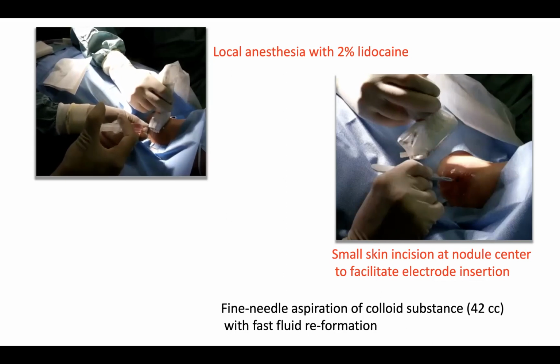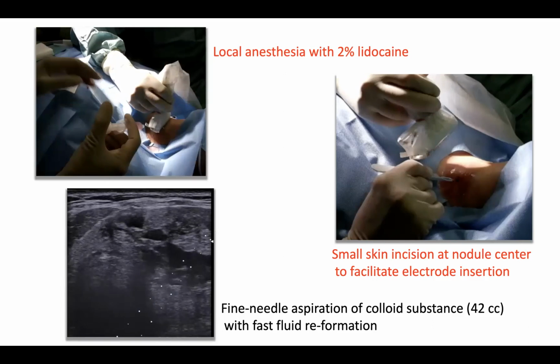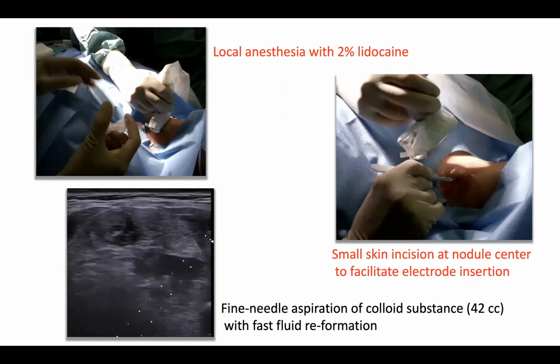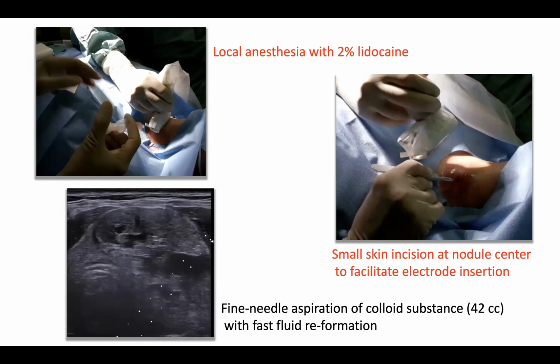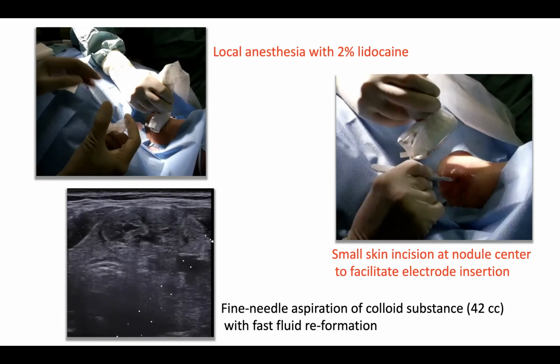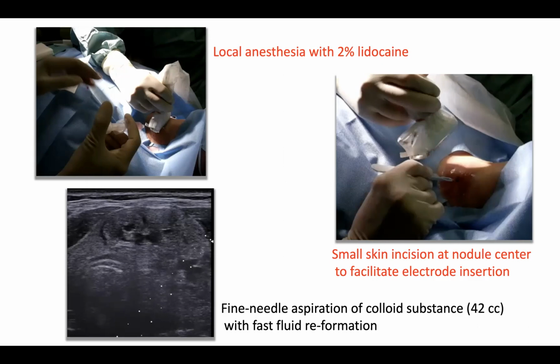Initially, during the procedure, we tried to extract from the lesion almost all the liquid content. And we were able to aspirate 42 cc's of fluid, but we noticed a very quick reformation of the fluid, making the procedure of aspiration completely useless.